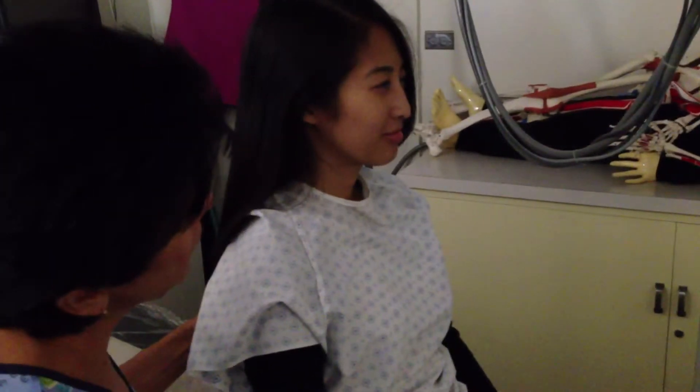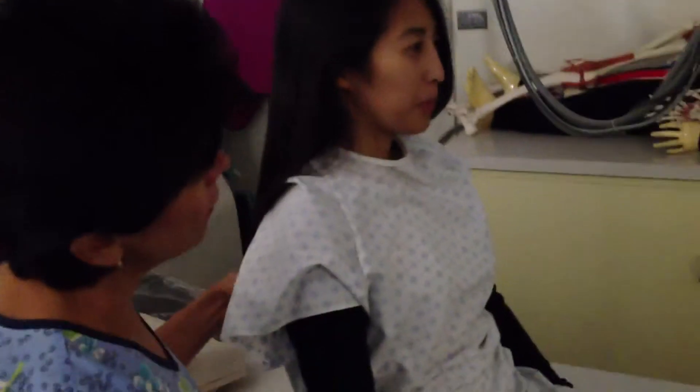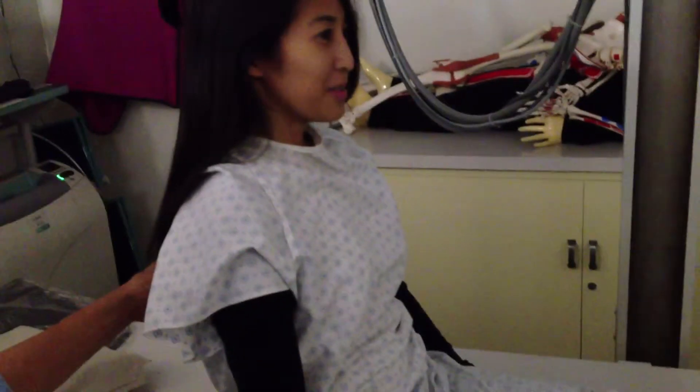I'm going to ask you to take in a deep breath two times, Catherine. The second time, take it in really deep and hold it, okay? Right now, Catherine, deep breath in. Blow it out. Another deep breath. Hold it. Boom.